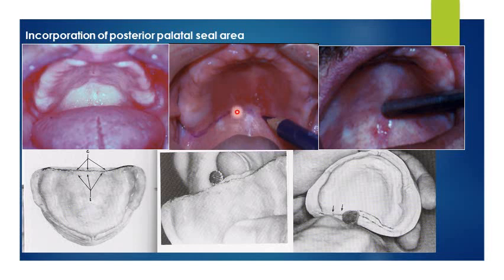But you should be sure not to put it on the hard palate, because the hard palate is not flexible tissue. The pressure of the denture in the palatal seal region here will lead to trauma, while here it is flexible tissue. It can be pressed a little bit to obtain the posterior palatal seal without any trauma.